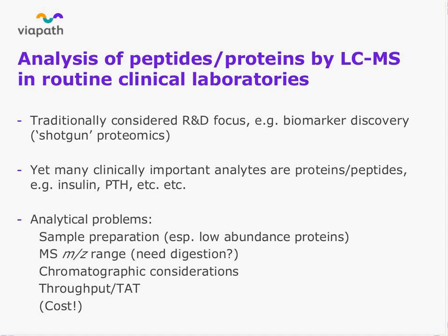Proteins, obviously, are larger than the small molecules, things like vitamin D and other steroid hormones, so we are in some cases limited by the actual mass range of the instruments that we're using. And you can do things like digest your protein to give peptides to overcome some of these problems, but that has its own inherent issues.